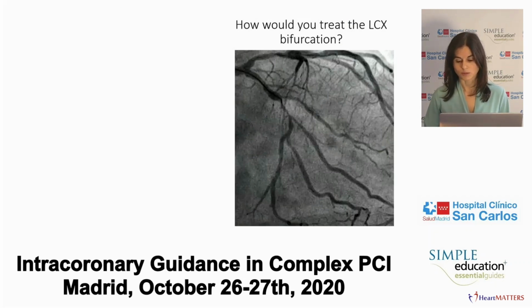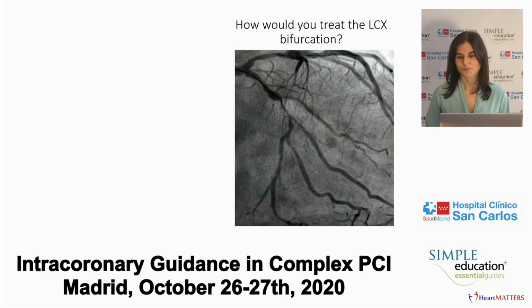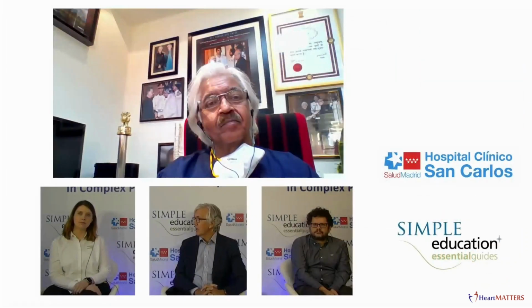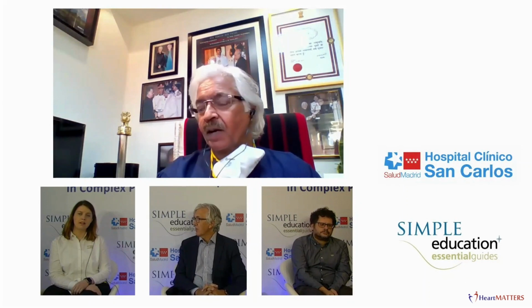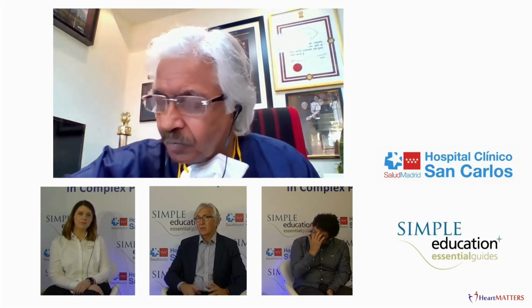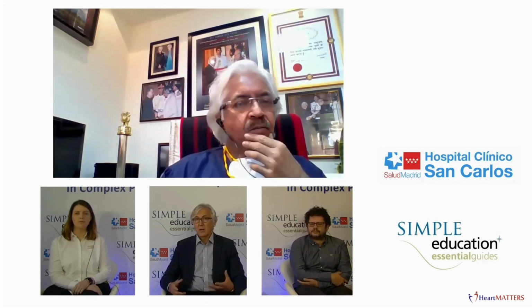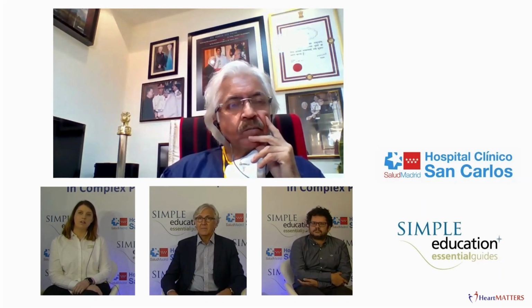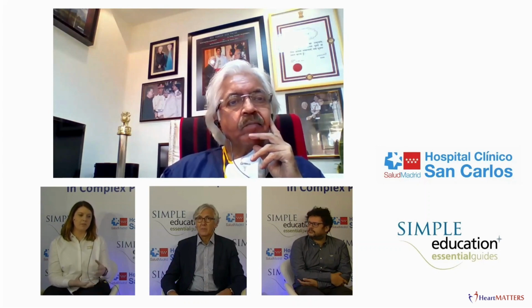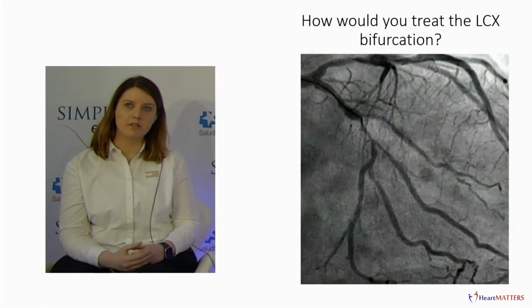Okay, well, you've got a very significant bifurcation, so we have to make sure that we're going to get an optimal result. So I think if we can do a provisional strategy but check the side branches with physiology afterwards to ensure that we have an adequate physiology result, then that's a possibility. But I think we would have to consider also a two-stent strategy in this lesion. It's a very complex lesion, a large territory. So I think we could also image this as well to gain some more information, and obviously that would be important to optimize the result as well.